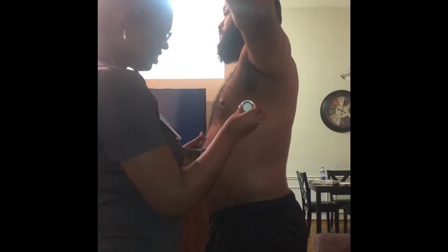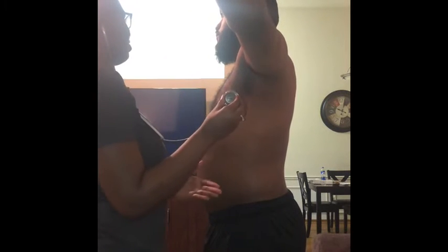Alright, I'm going to have you turn to the side. Arms out. I'm just going to listen to your lung sounds on your side. So just take a deep breath for me when I place my stethoscope.